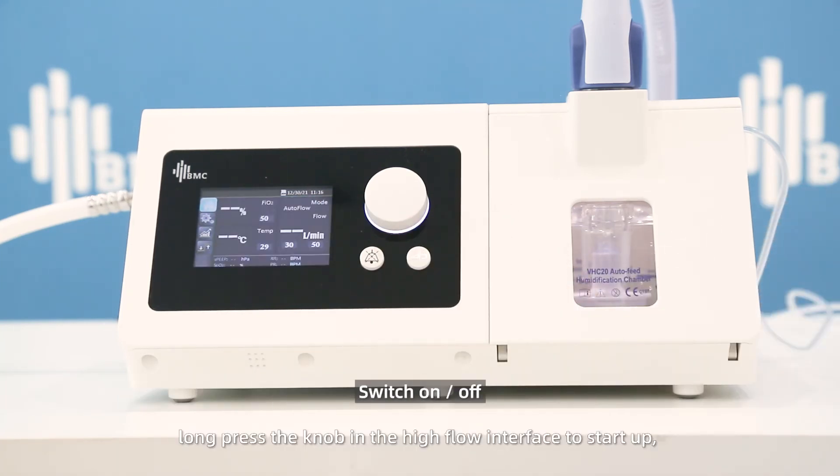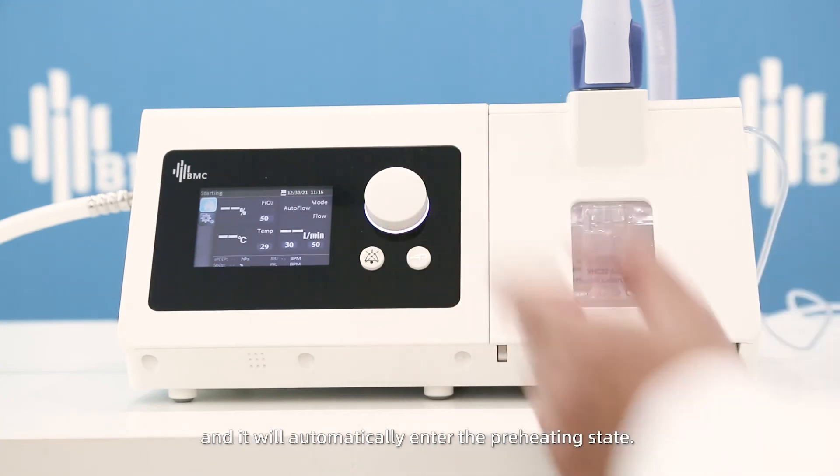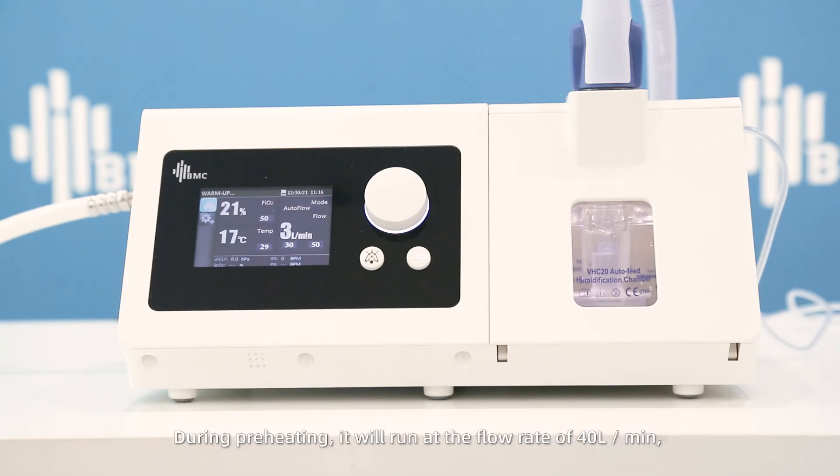Long press the knob in the high flow interface to start up, and it will automatically enter the preheating state. During preheating, it will run at a flow rate of 40 liters per minute, and there will be a prompt after preheating is completed.